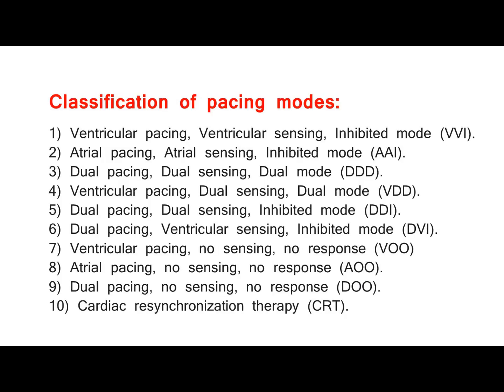Single chamber pacing. Classification of pacing modes. 1. Ventricular pacing, ventricular sensing, inhibited mode, VVI. 2. Atrial pacing, atrial sensing, inhibited mode, AAI. 3. Dual pacing, dual sensing, dual mode, DDD. 4. Ventricular pacing, dual sensing, dual mode, VDD.